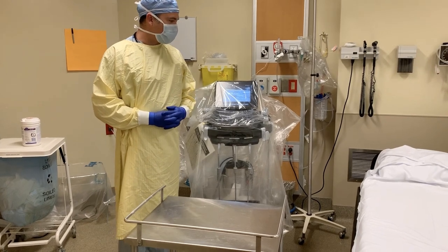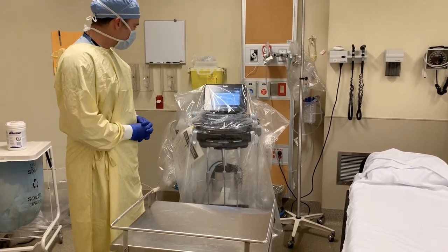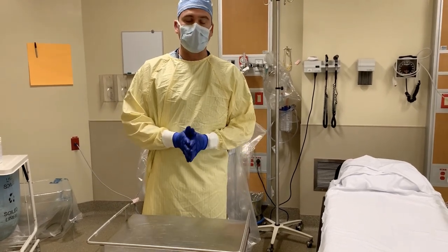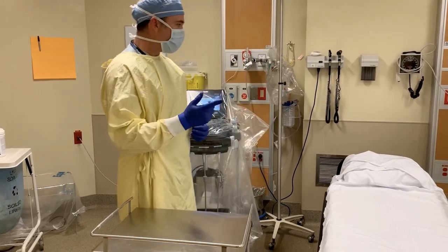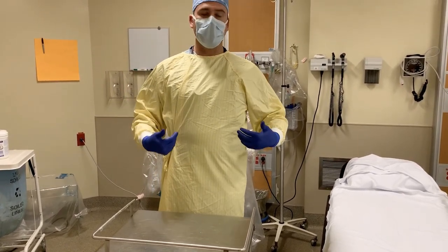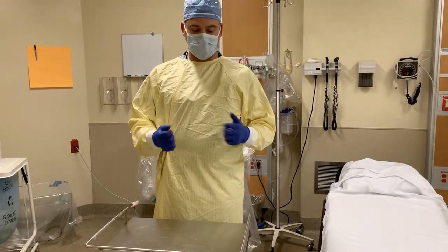Now I've deemed that there is to be a sterile procedure done with ultrasound in this patient, such as the insertion of a central venous catheter. At this point I would have a sterile field created with my central venous catheter tray, which I did not open yet because I don't want to waste precious supplies. I would also have a second pair of sterile gloves, as well as a second set of sterile equipment to perform this procedure on top of my PPE. Again, I don't want to waste those supplies in this pandemic.